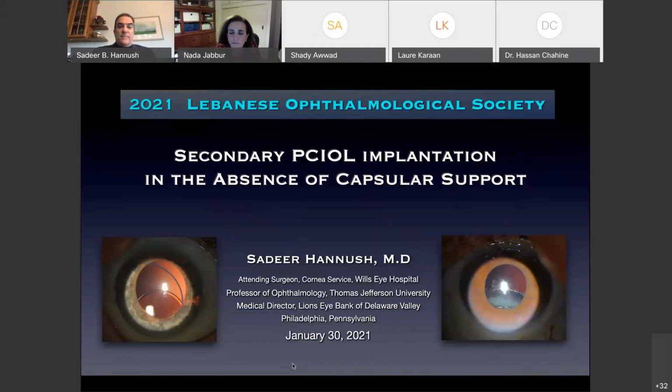So I'll get started. The topic here today is secondary posterior chamber intraocular lens implantation in the absence of capsular support. I have a lot to share with you. I've been interested in this topic since finishing fellowship in 1988. And obviously the field has evolved tremendously.